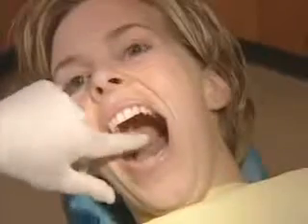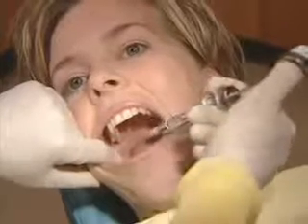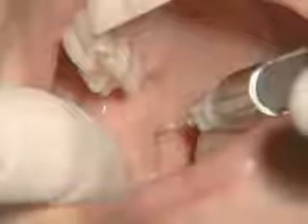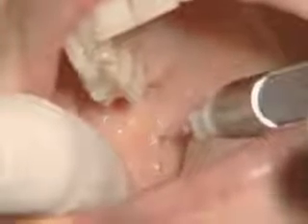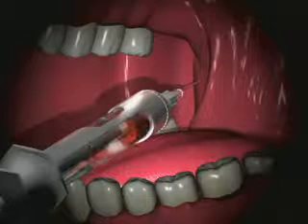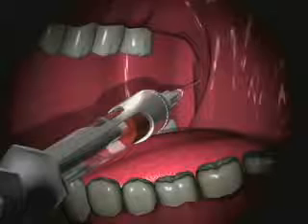After palpating the landmarks, you will be inserting the needle into the pterygotemporal depression. The needle is brought in from the contralateral side, and the insertion point is directly there, and advance slowly until you go 25 millimeters. Once bone is hit, you withdraw slightly, you aspirate, and slowly begin to inject a full cartridge of local anesthetic, unless you are following with a buccal nerve block, in which case you should inject 3/4 of the cartridge.